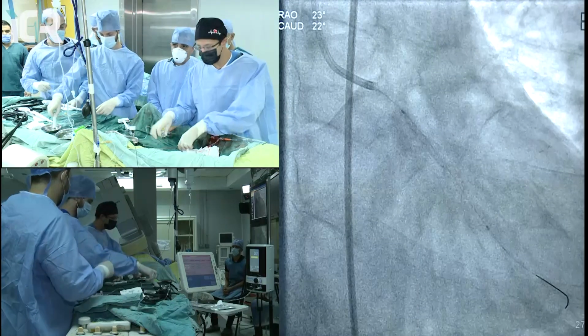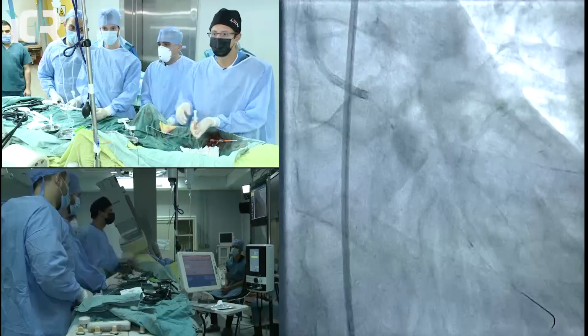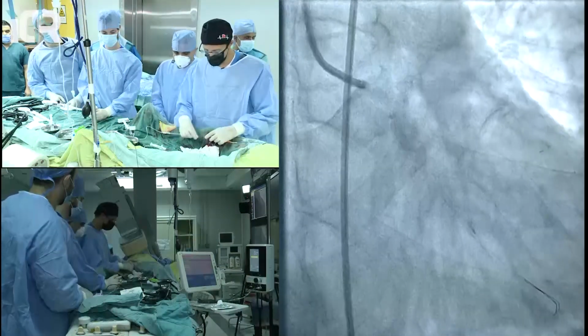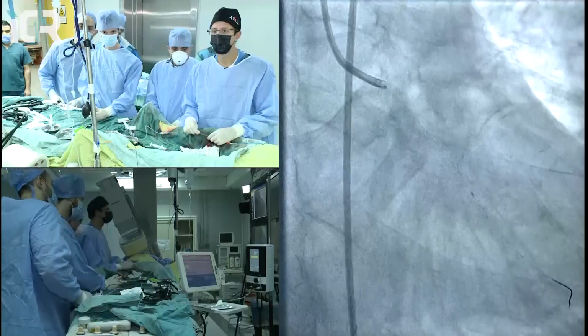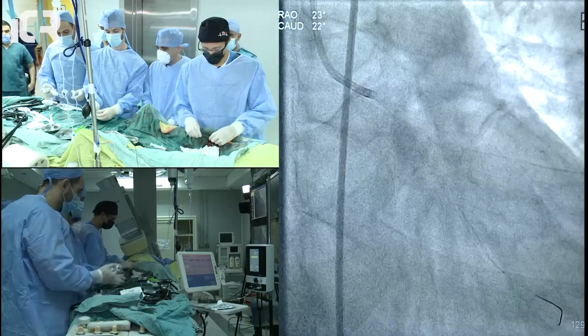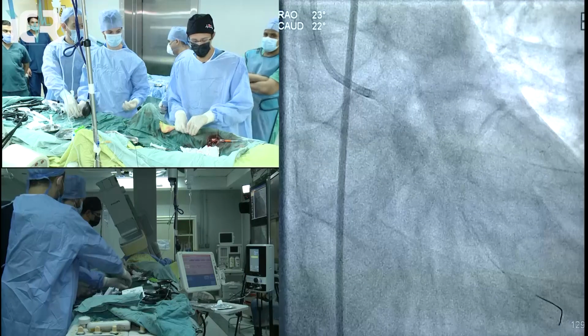I'll take a test. So we have a good hemodynamics. I think it looks good. We need to check ACT.